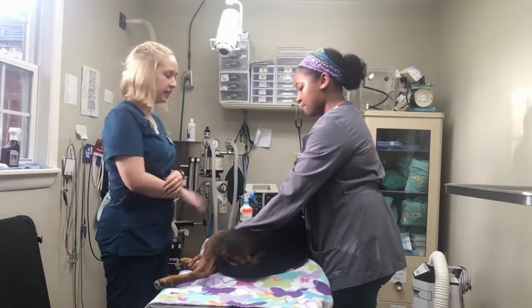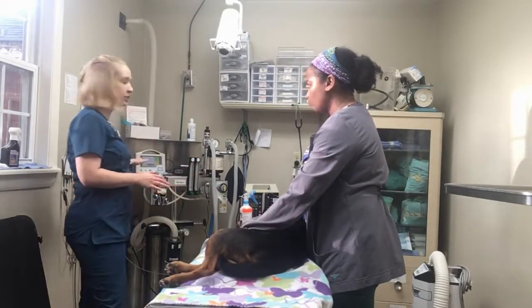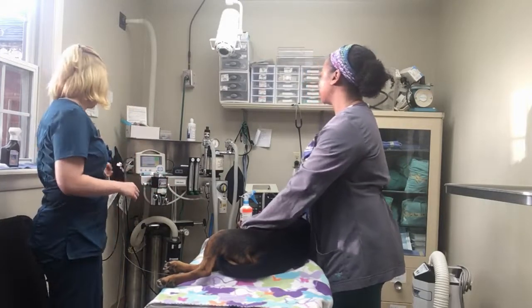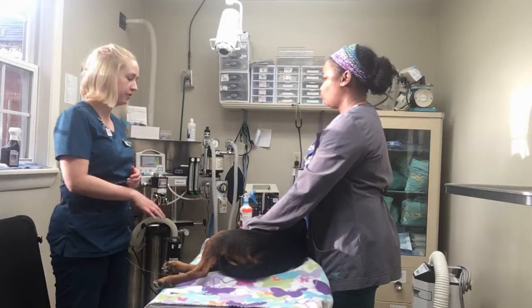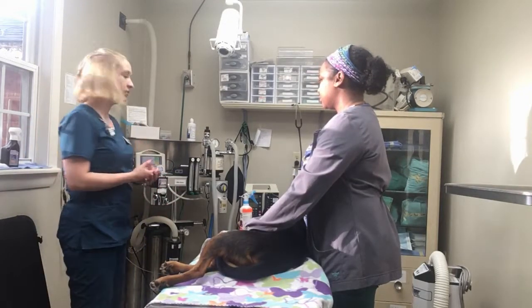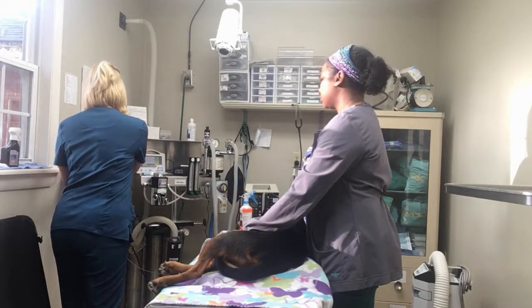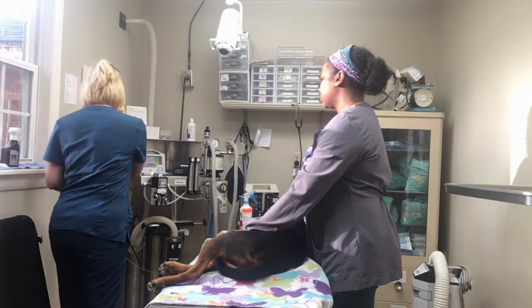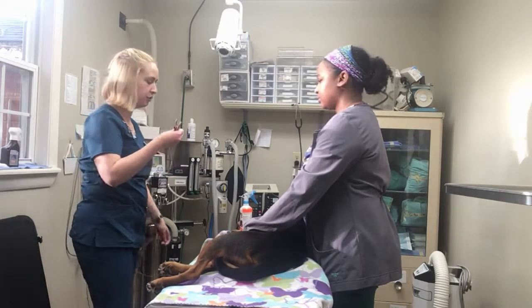I've got Rudy here, and today we're going to be performing an ECG on him. I've got my machine all ready to go. It's turned on. The first thing you're going to do is make sure he's not on a conductive surface. So we've got him on a blanket right now. And then you're going to place your leads. The first one you're going to place is your white lead, which will go onto the right front.